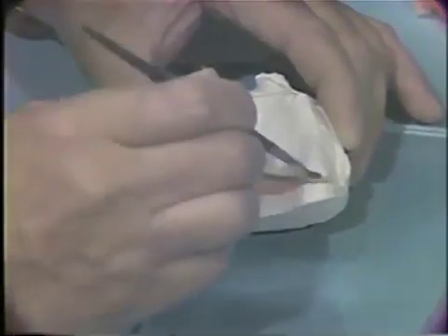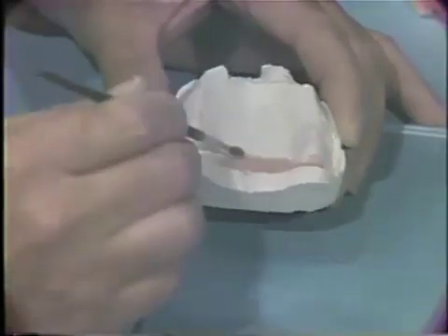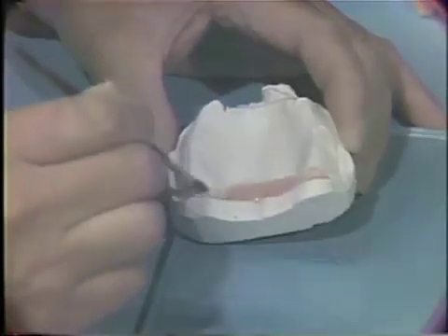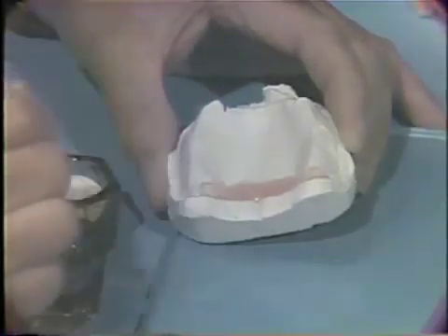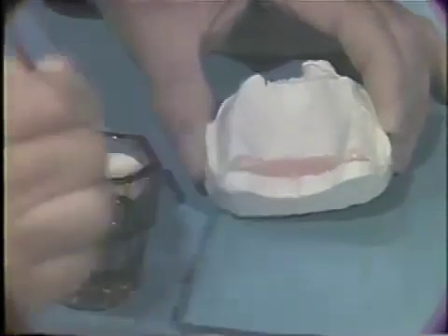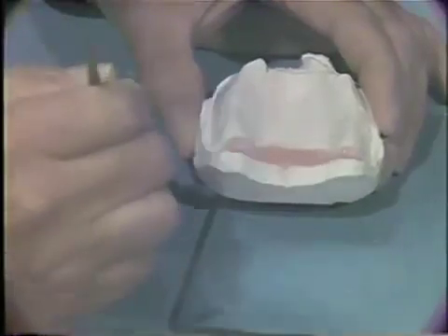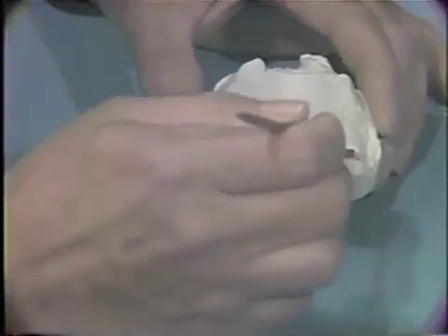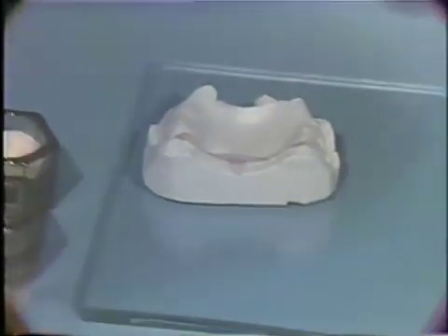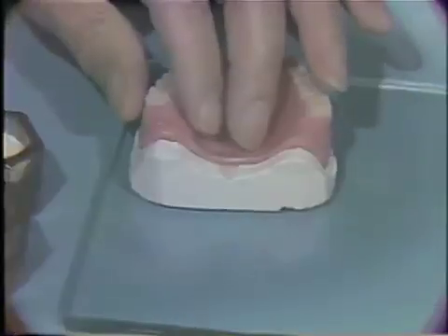Add more monomer and polymer until the site is slightly overfilled. When this is done, place the maxillary denture back into the impression plaster cast and be sure it's seated securely. Then, set the cast and denture aside for approximately five minutes until the acrylic resin reaches the doughy stage.